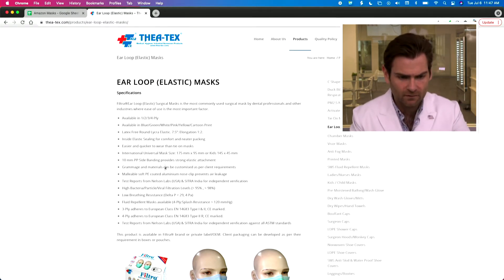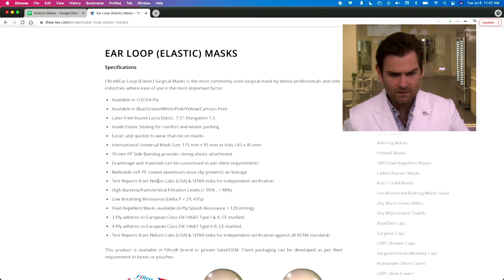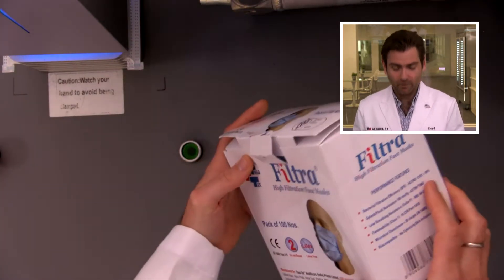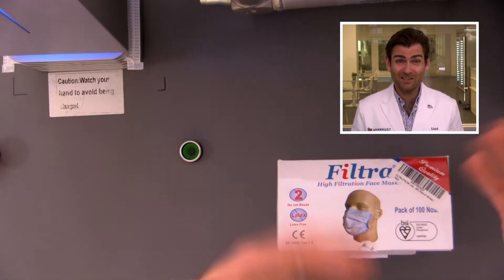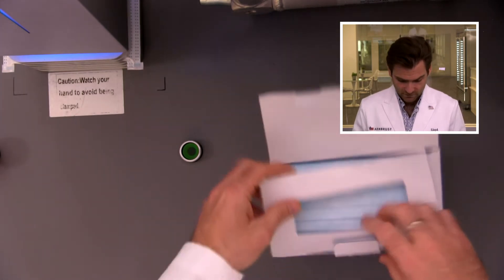Looking on their website, they have a three-ply and a four-ply. This is the three-ply type one and type two. Let's look at the box real quick. It's not soft touch, but I like the box. As we've seen in some of these videos, actually the better the packaging, a lot of times it does compare with how good the actual product is itself.